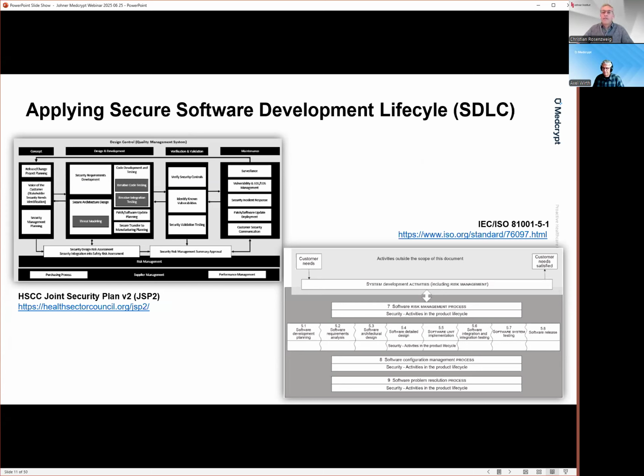And a similar approach has the IEC 81001-5-1 on the right side, with its process framework that was copied from the IEC 62304, the software lifecycle management standard. As the 81001-5-1 is the recognized consensus standard in the US, this is the big similarity between both markets.